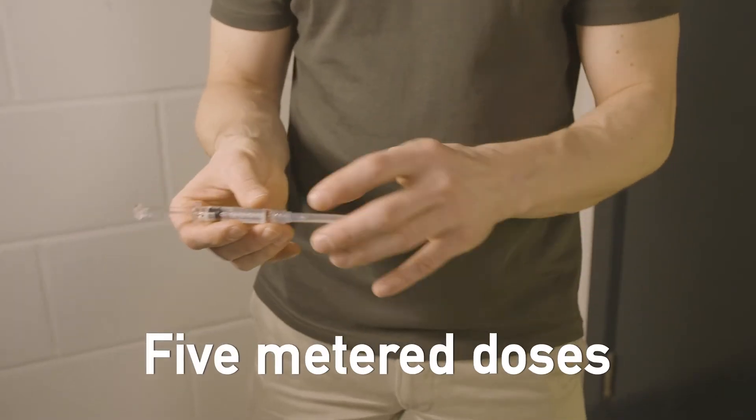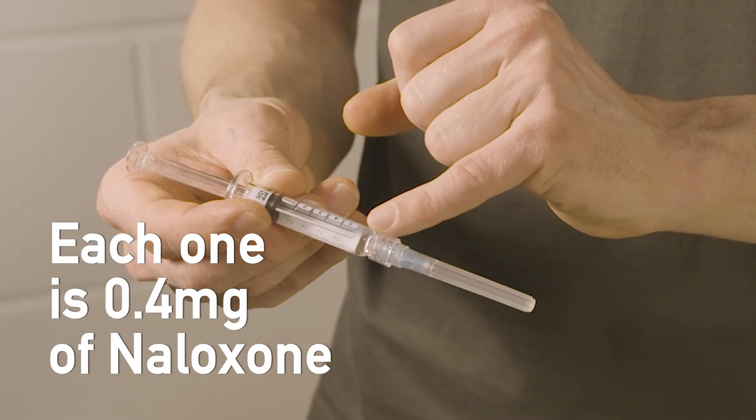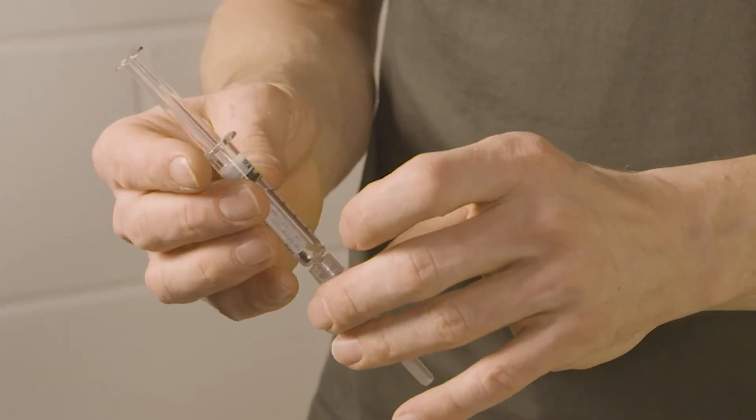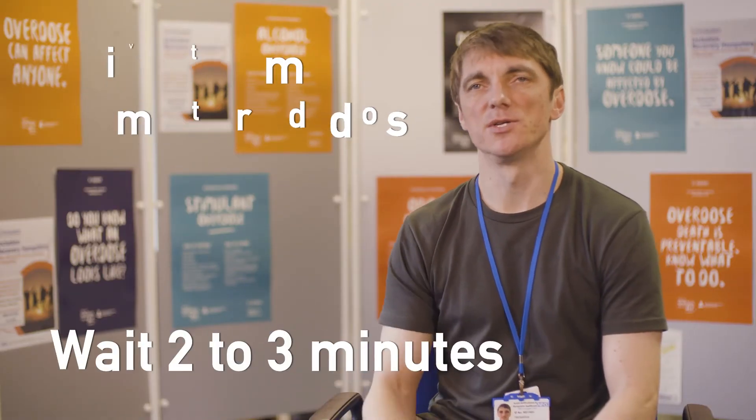There are five doses marked on the syringe, each one is 0.4mg of naloxone. You're not going to hurt them by giving them too much. Give them one dose and wait two to three minutes.